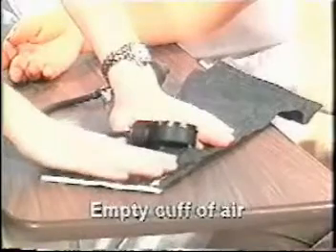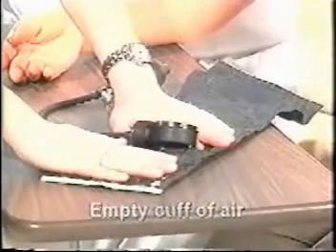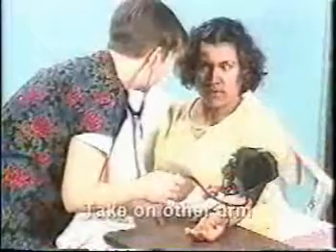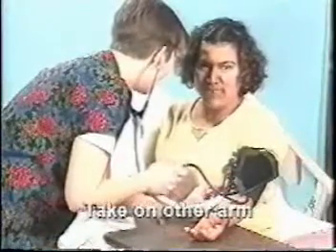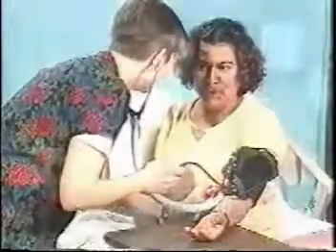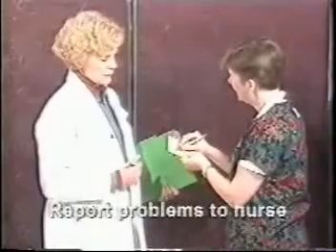The cuff must be completely empty and flat before placing it on the arm. If you're unsure of your reading, you may wait 1 minute or longer and then retake the blood pressure on that same arm, or you could try taking the blood pressure on the opposite arm. If after 2 attempts you just are not certain about your blood pressure reading, then ask the nurse for assistance.